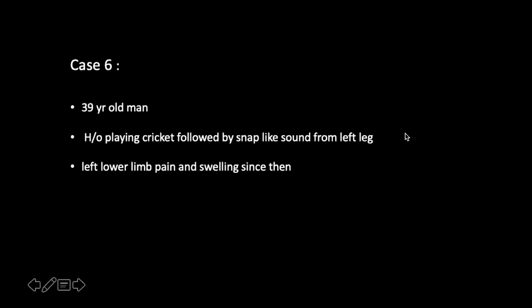So treatment is conservative management, but if it is causing a lot of pain, then surgical repair, but you have to take care that there can be a risk of compartment syndrome. Differential diagnosis is vascular malformation, benign soft tissue tumors, but on dynamic evaluation during stress, you can see the muscle herniation very well. So ultrasound is the gold standard for this.